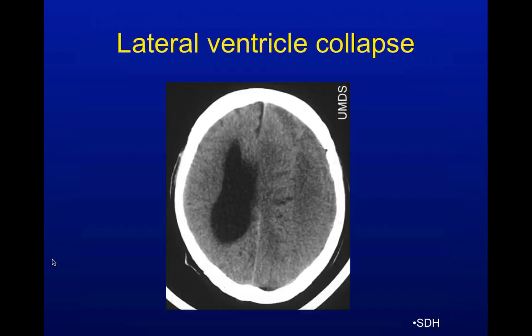All right, lateral ventricle is collapsed. It's clearly not symmetrical. Why is that ventricle collapsed? Look hard. Yeah, some folks are saying it. Look closely here. There's a line right there, and everything here is kind of a uniform gray, whereas here is kind of the normal gray matter with some gyri in it. This is a huge subdural hematoma, gigantic subdural hematoma. It's isodense. It looks the same density as brain. This one's easy to miss if you're not paying attention. You just think, oh, wait a minute, where's the ventricle? And what's happening? Something has to be making it collapse. Okay, that clues you in.